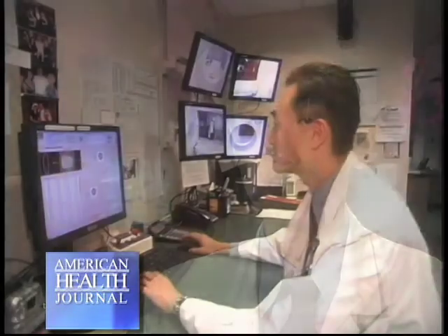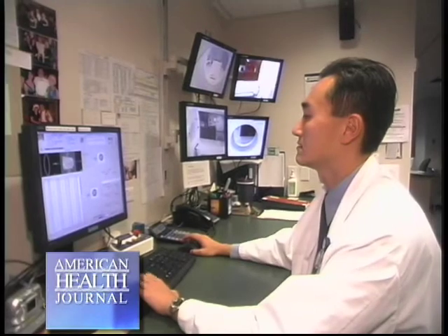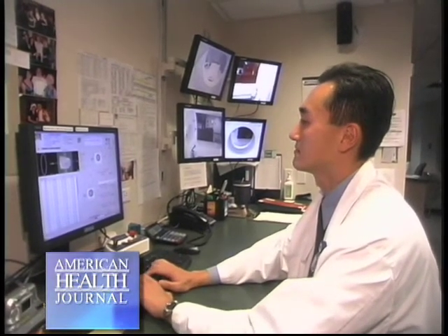The way tomotherapy works is you get essentially real-time imaging before your treatment. You can actually see where you're treating as opposed to conventional machines where patients are lined up using external markers and the radiation beam is turned on with the assumption that everything internally is lining up to what you planned. Of course, we all know that's not the case. Things can shift around internally. Tumors can move around. Your normal organs in your body can shift around on a day-to-day basis.